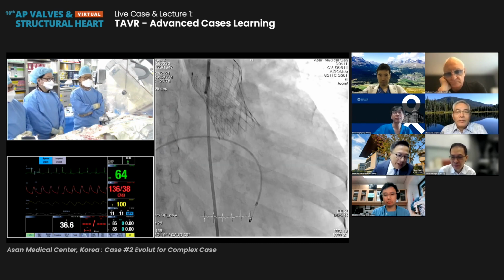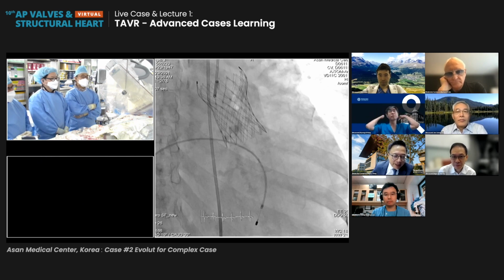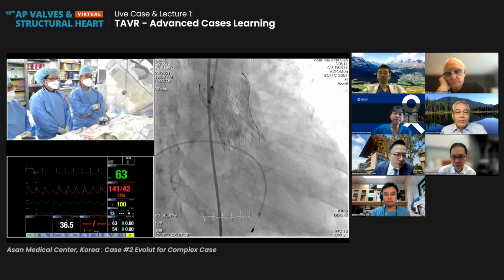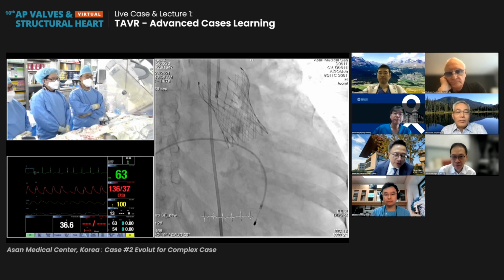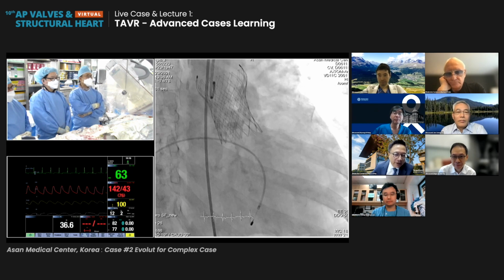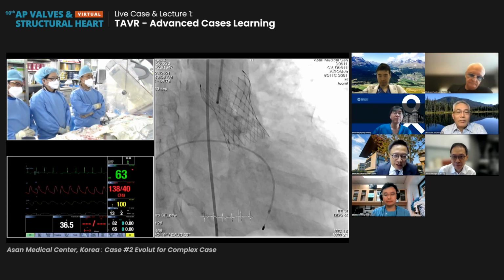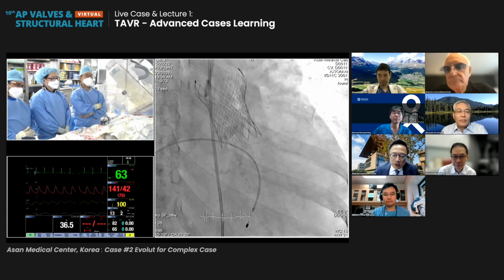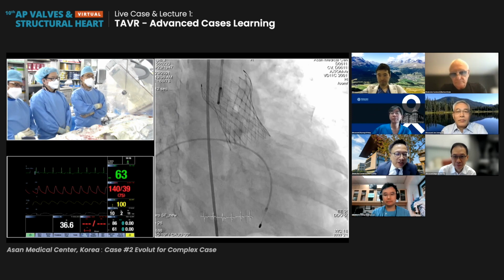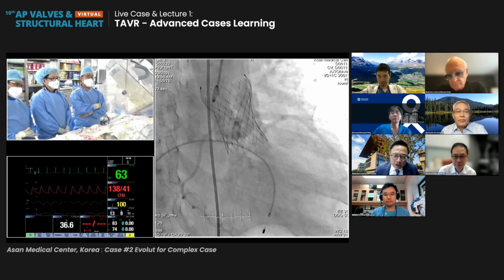So it actually pulls away a little bit. So a very good pre-procedure planning that sometimes in these live cases is not so well presented in that way, right? Because you thought through it already. Look at the height, look at the skirt, and you actually in your own head kind of know what you are doing in much greater detail than you presented. So I think again, the devil is really prepare these cases well and plan what you're doing and execute it. So I think you've done a great job.